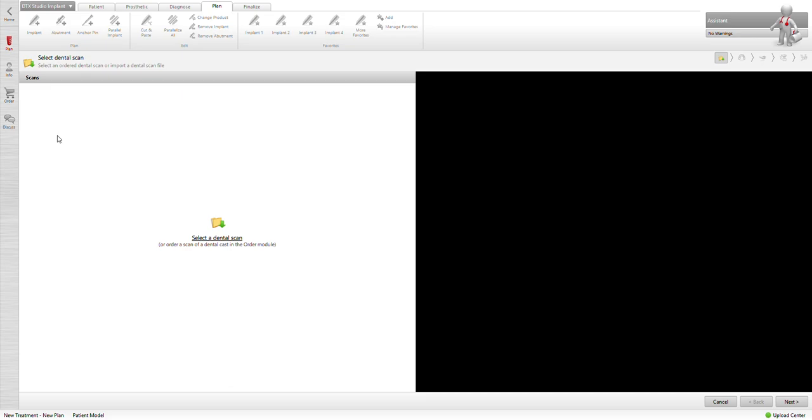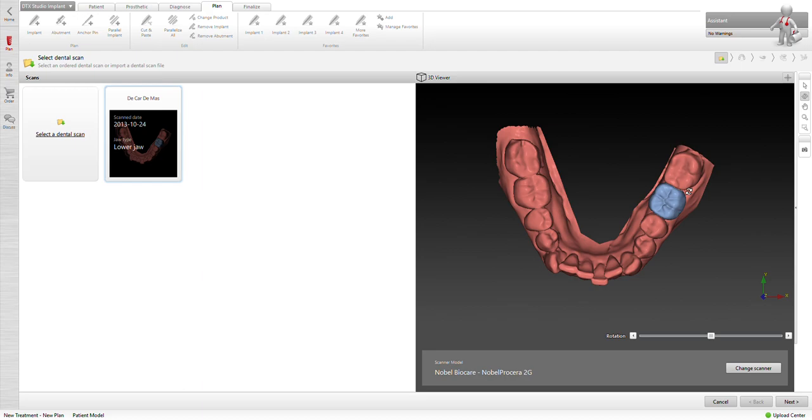Alright, we want to also set the lower jaw and then we can add our dental scan, intraoral scan here, simple as doing importing our DICOM file. Again, it's on desktop, it's under lower molar Procera.